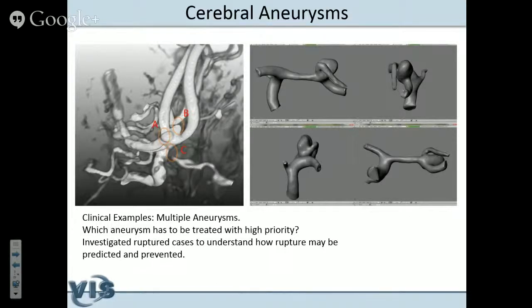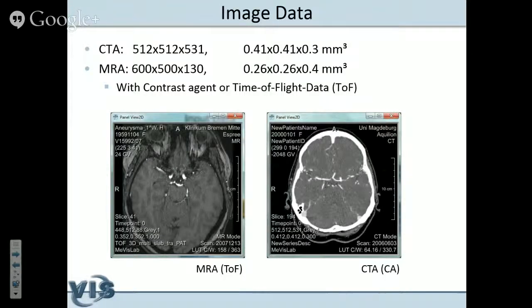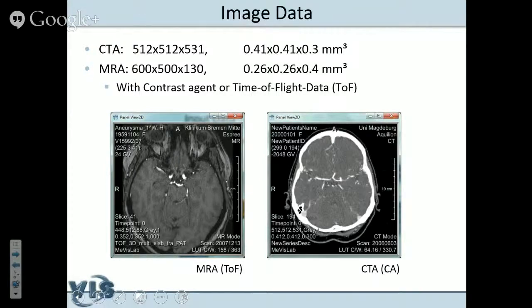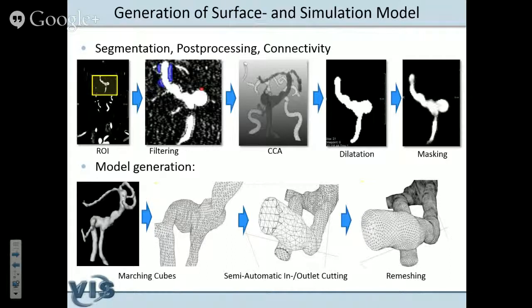Here you see an example of patient data derived from CT data. This patient has three aneurysms simultaneously — if you have a condition of developing aneurysms, you may develop more than one. The most pressing clinical question is which aneurysm should be treated first, since they would not treat all of them simultaneously. We derive surface models from these data and use them for the CFD simulation to come up with good visualizations for clinicians. The image data used are either CT angiography, MR angiography, or MR time-of-flight data.